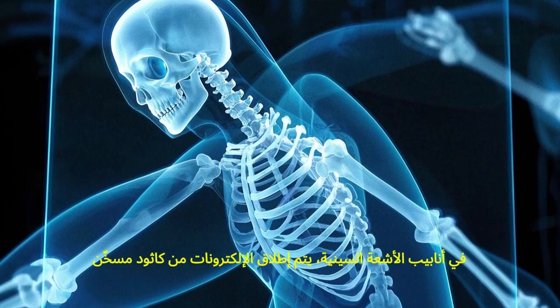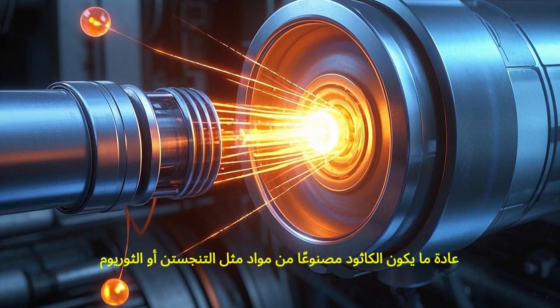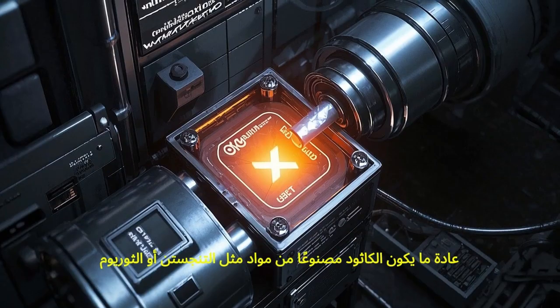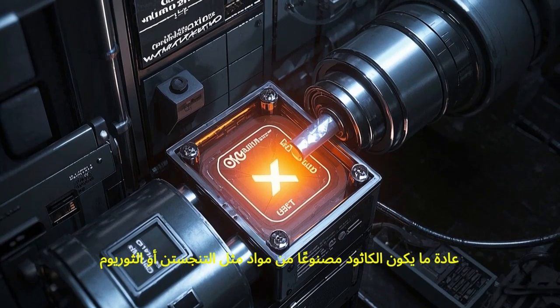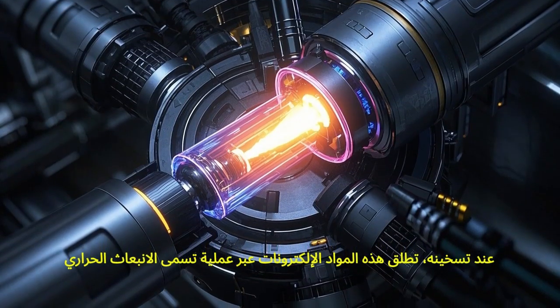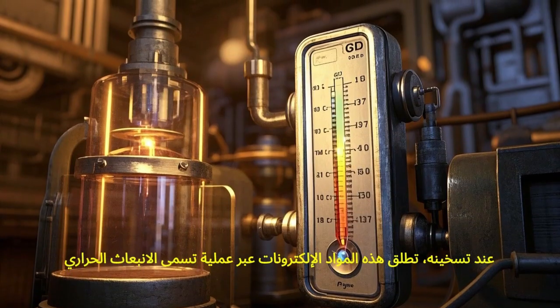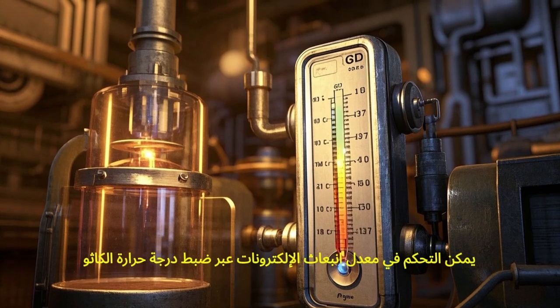Now let's look at some key points about X-ray production. In X-ray tubes, the electrons are emitted from a heated cathode. The cathode is typically made of a material such as tungsten or thorium. When heated, these materials release electrons through a process called thermionic emission. The rate of electron emission can be controlled by varying the temperature of the cathode.